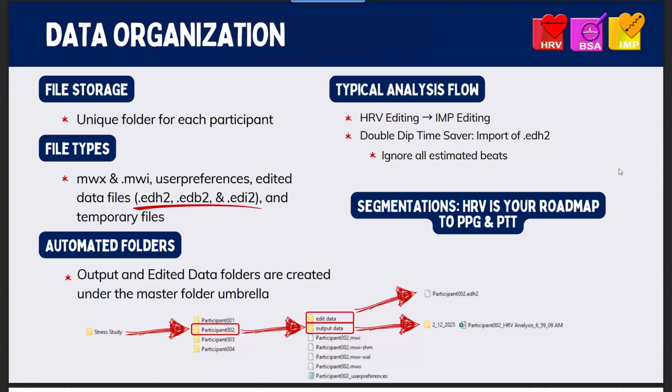And talk a little bit about some of the data organization on the back end that I didn't go over today, but if you're familiar with our programs, you are used to this type of data organization and file structure. So when we're working with multiple waveforms, it's important that we get our analysis pipeline correct.